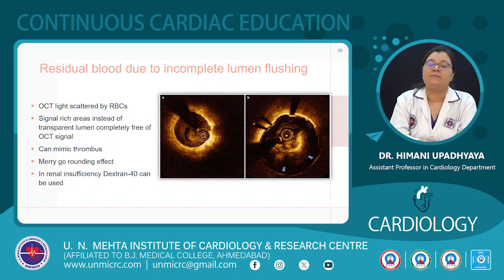Then due to inadequate flushing of the coronary during OCT, there is residual blood, and it can mimic thrombus, it can cause a merry-go-round effect. So signal-rich areas instead of a transparent lumen completely free of OCT signal can also mimic thrombus.